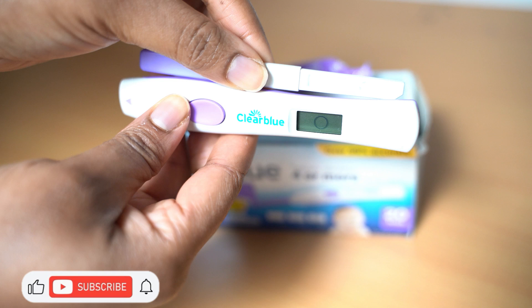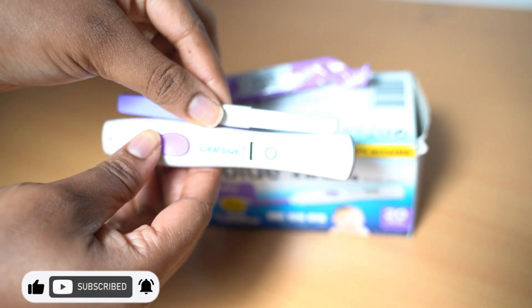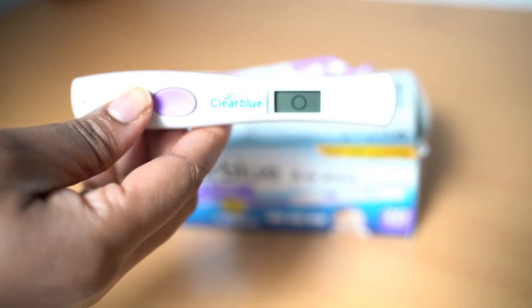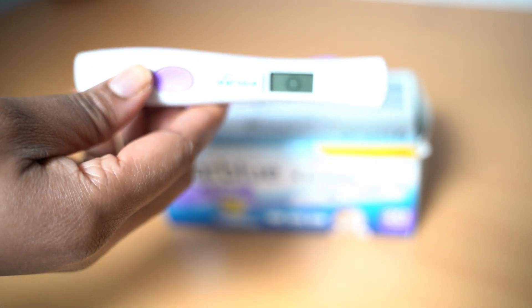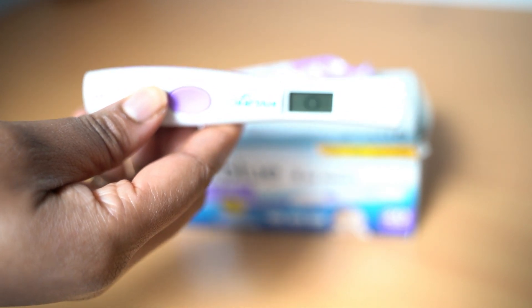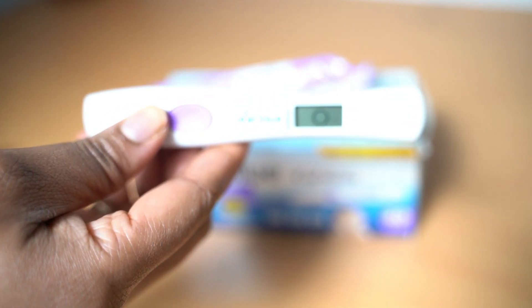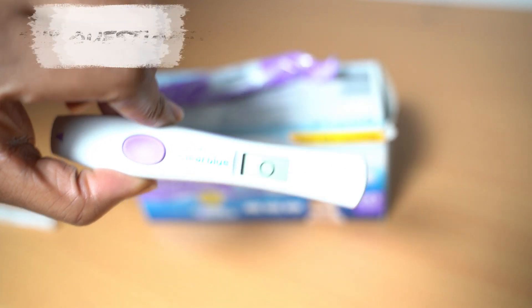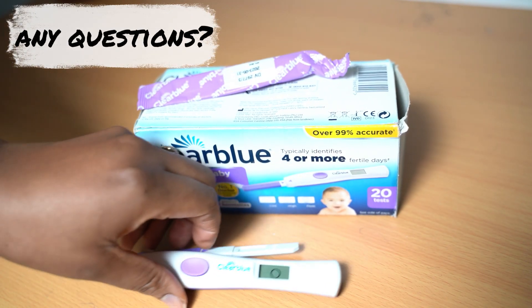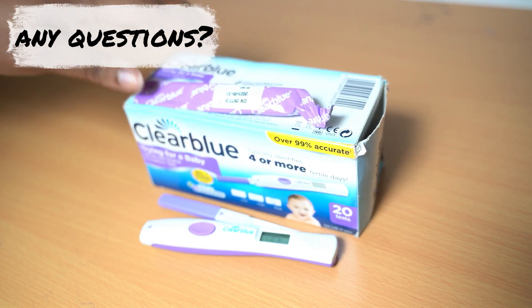Then you throw the strip away. The display is going to stay like this for a couple of minutes before it disappears — it's not going to disappear straight away. Don't forget that this is one of the three results that you're going to get. Guys, thank you so much for watching — if you have any questions on how to use the Clearblue ovulation kit, please let me know in the comments and I'll be able to help you.